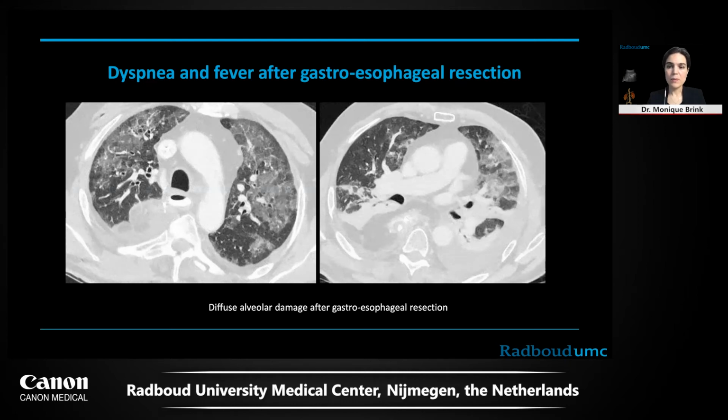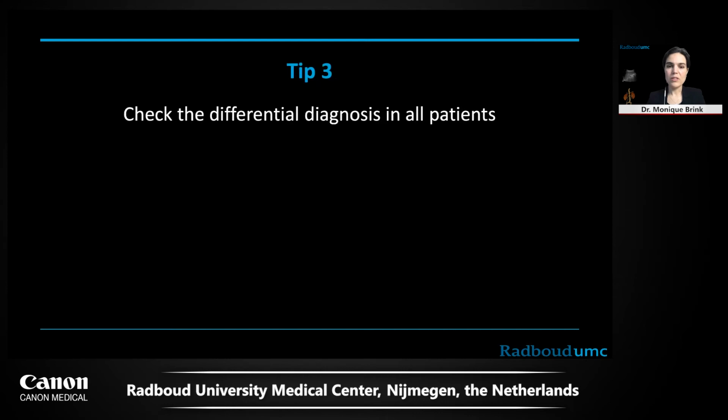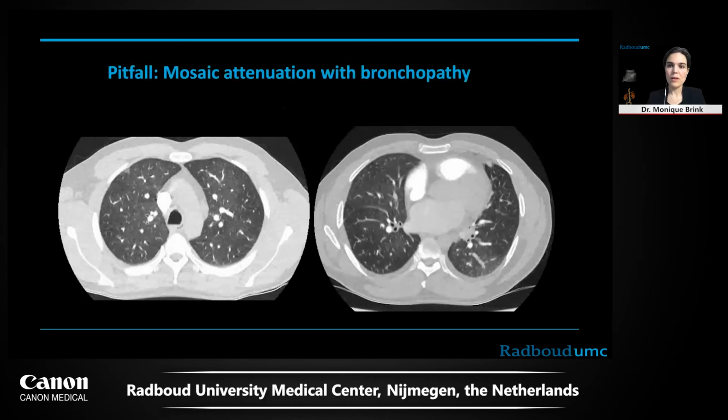And that takes me to my final tip. Always check the differential diagnosis, because this was an ARDS, a normal ARDS in a post-operative patient. Check your pitfalls. For instance, mosaic attenuation in a patient who was scanned with intravenous contrast, and hypoxic vasoconstriction and bronchopathy. This is not ground glass.